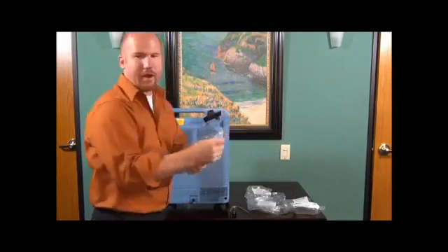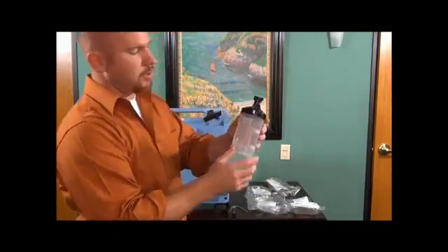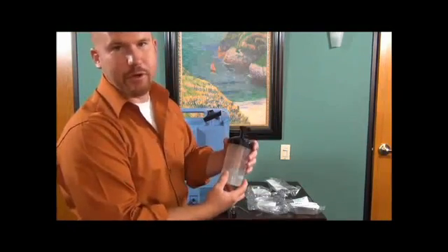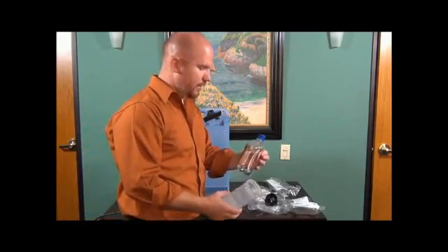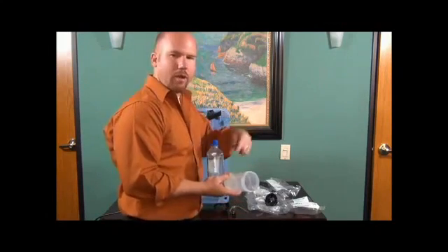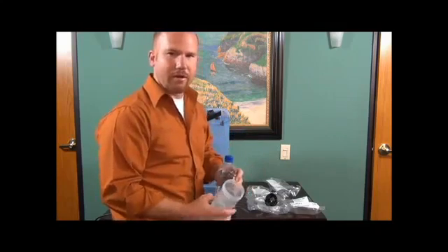Then you'll take your humidifier bottle out of the package. And then on the humidifier bottle, you'll see a maximum line and a minimum line, and that's usually posted on most of your humidifier bottles. You'll unscrew it. Take water. We recommend that you use distilled water, just for the simple fact that distilled water has no impurities in it whatsoever. So when the air runs through it, there's no little particles that will get into the hose causing it to clog up. So we recommend that you use purified or distilled water.